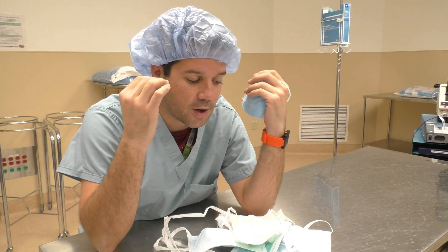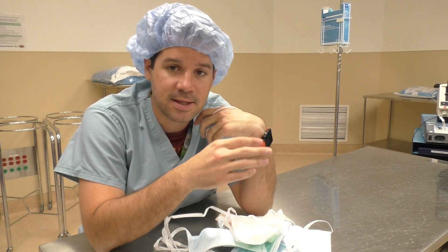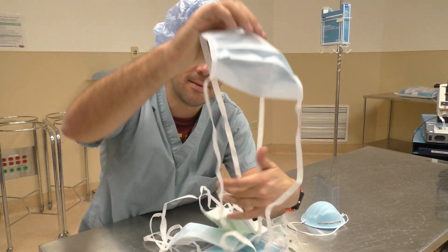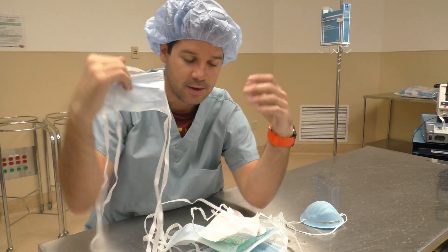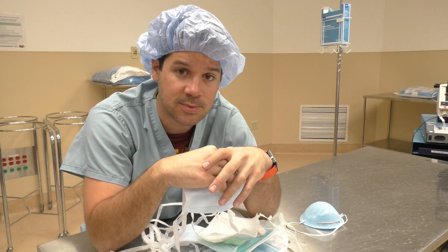This type of mask doesn't properly cup your face and under your chin as a tie-back mask would. So if you are in surgery and you are at the field, the mask you should be wearing is a proper tie-back mask. It's got ties at the top and ties at the bottom — you tie them on the top and bottom of your head. I'll show you how to tie it properly as well in this video.